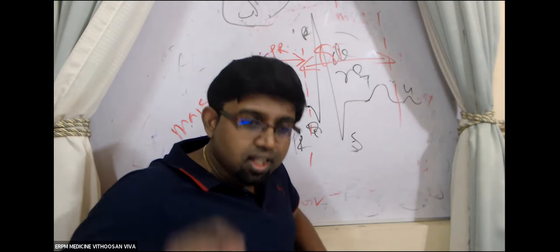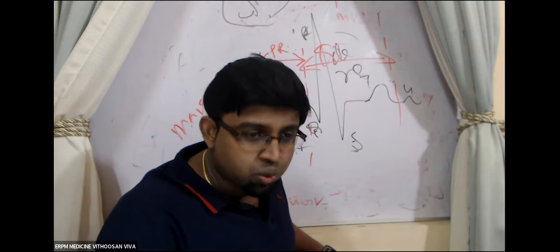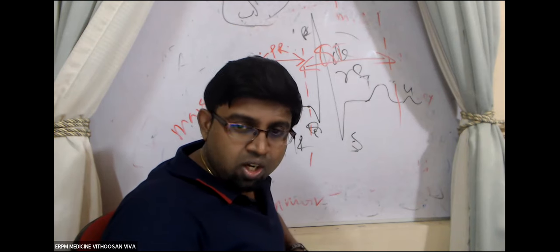Since the QT interval is changing with the heart rate, ideally speaking, we have to adjust the QT interval according to the heart rate.